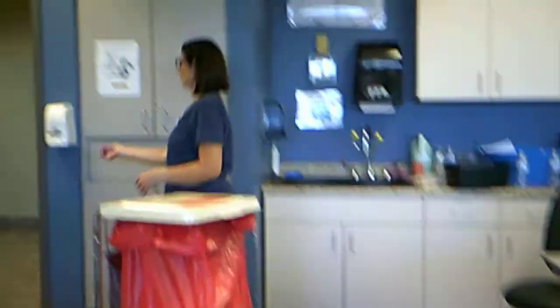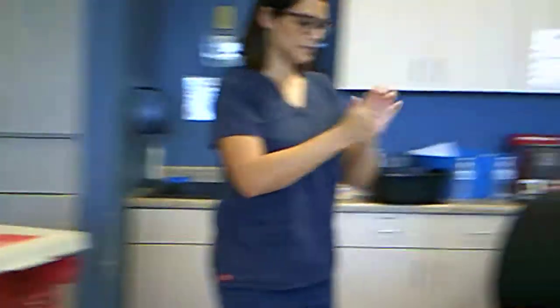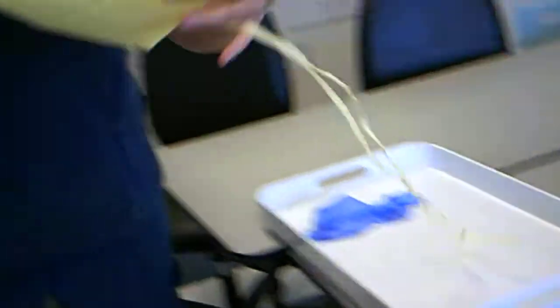I'm going to put my gown and gloves on. First, I'm going to set my hand sanitizer aside. I'm going to put my gown on.